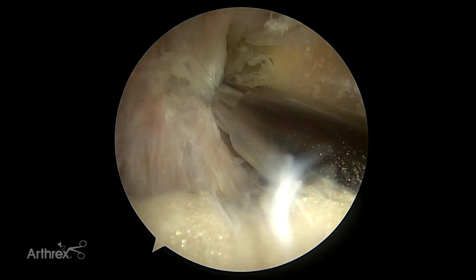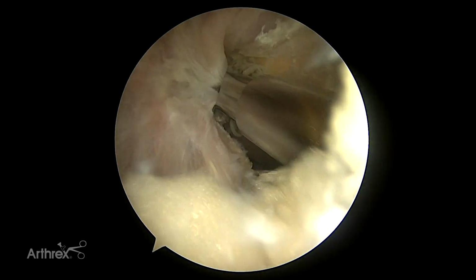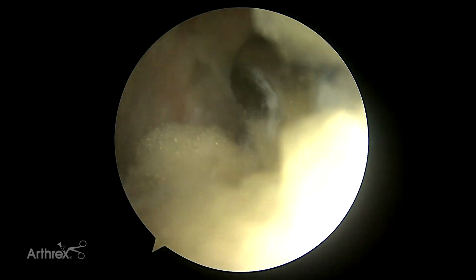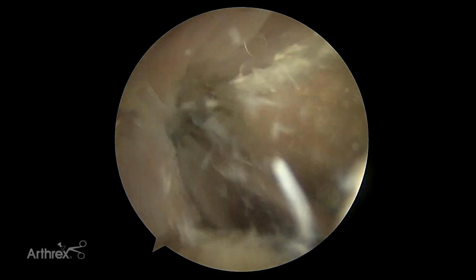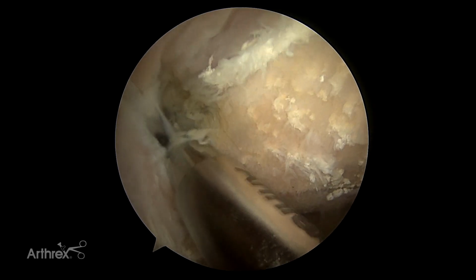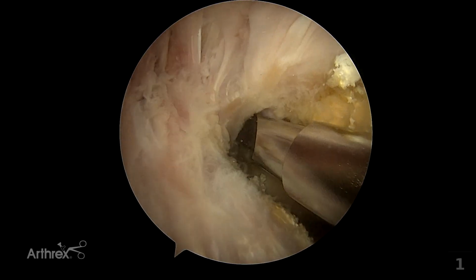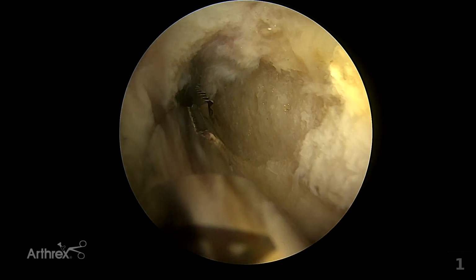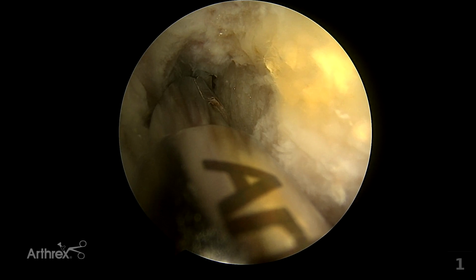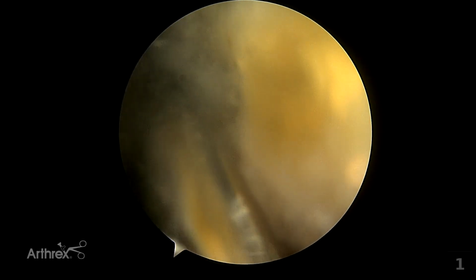You can give this notch what I call a high and tight. Tight up against the posterior medial PCL and tight up against the ACL without hurting it for the eminence. So I'll do the wall first from front to back, and you can go back and forth. We're gonna focus mostly on the wall right now. It really is like a fine-tooth, well-controlled burring in planar mode with your wrist motion forward and back, so there's no chance of slipping off. So I can get right up on myself and do a controlled resection.